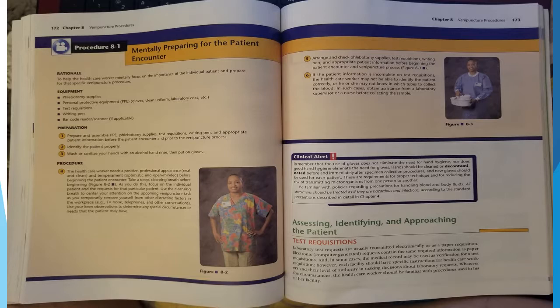As you do this, focus on the individual patient and the request for the particular patient. Use the cleansing breath to center your attention on the upcoming venipuncture task as you temporarily remove yourself from other distracting factors in the workplace, such as noise, TV, telephones, or other conversations. Use your keen observation to determine any special circumstances or needs that the patient may have.